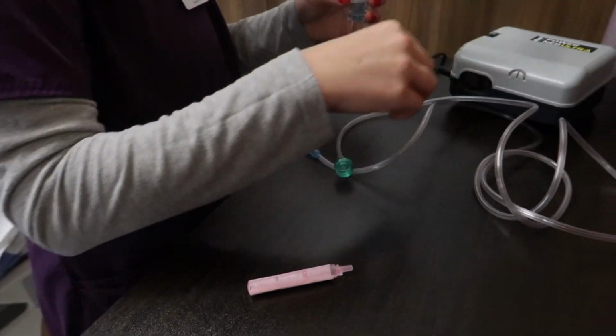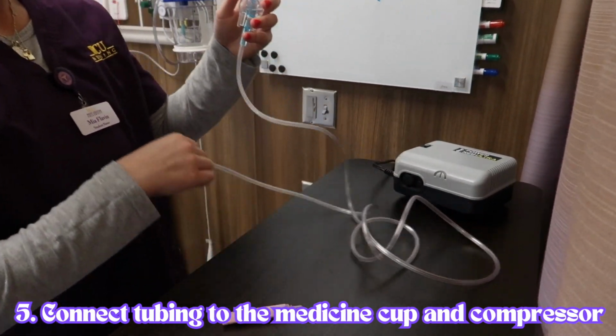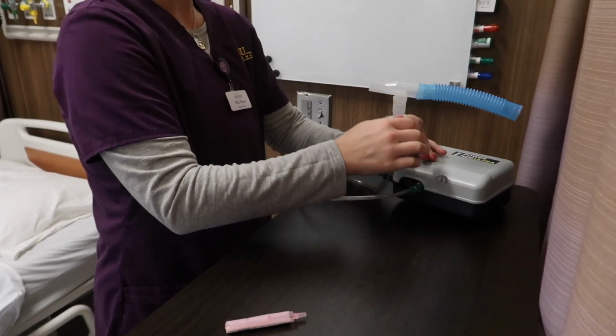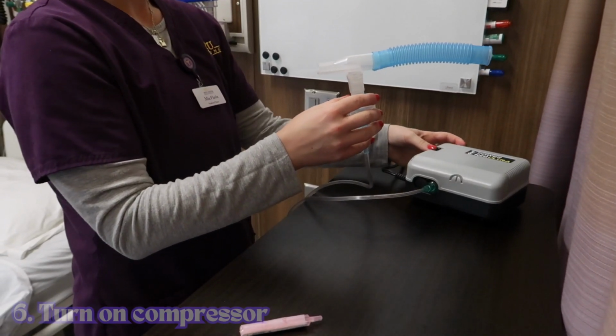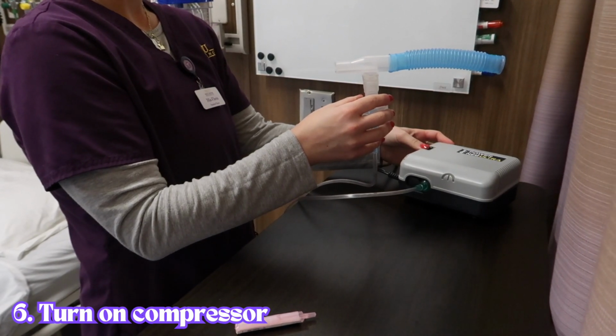I'm going to take our tubing that we use and connect it to the bottom of the medicine cup, and take the other end of the tubing and connect it to the compressor. And once those two tubing connections are securely tied on, we'll start our nebulizer treatment.